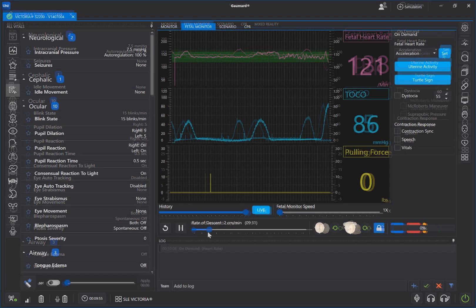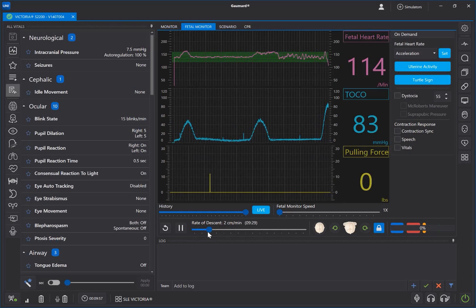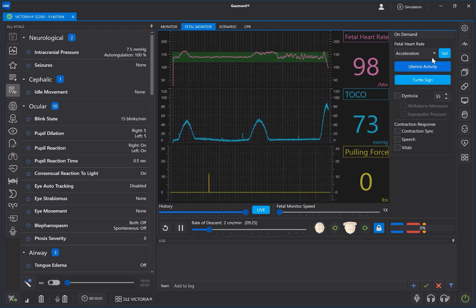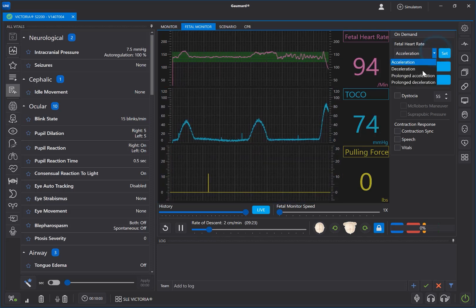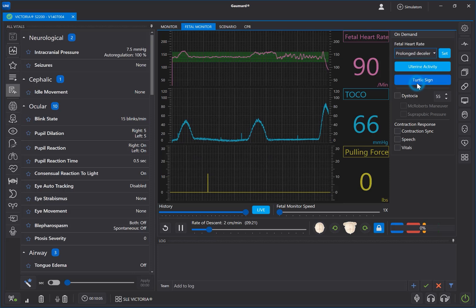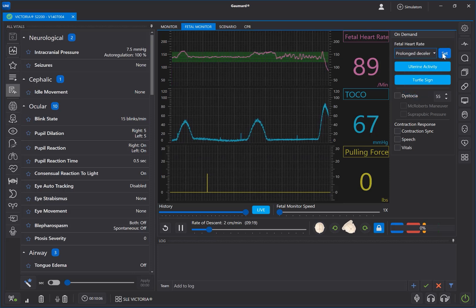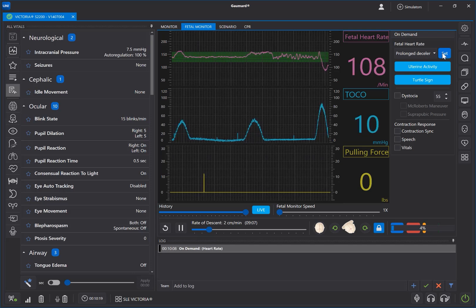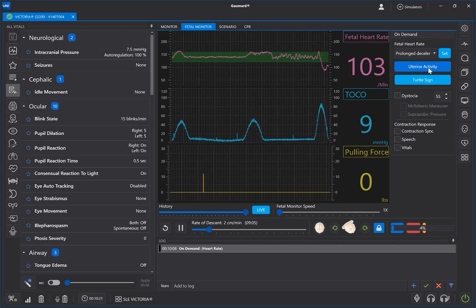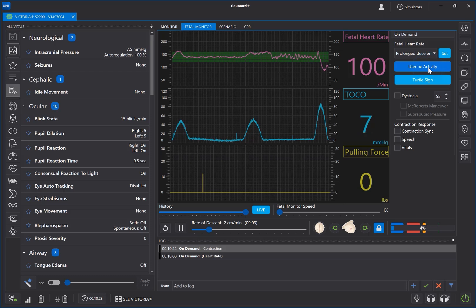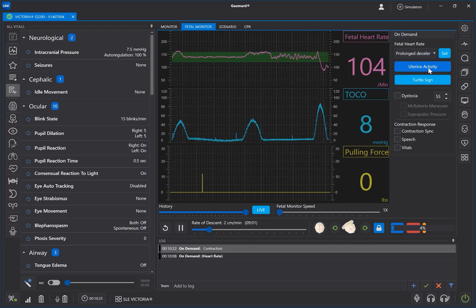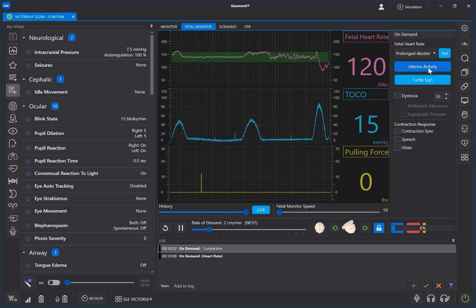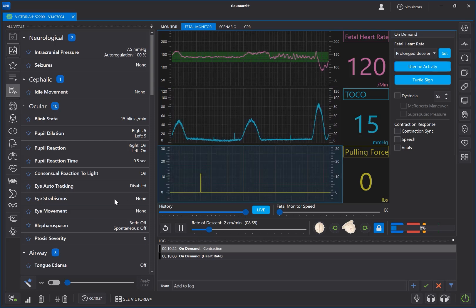There are many ways to customize an on-the-fly labor. To cause a spontaneous change to the fetal heart rate, first choose the type of change from the drop-down menu, then click Set. To create additional contractions, click Uterine Activity. You can program the specifics of these contractions in the Fetal Monitor subsection of the Vitals menu on the left.